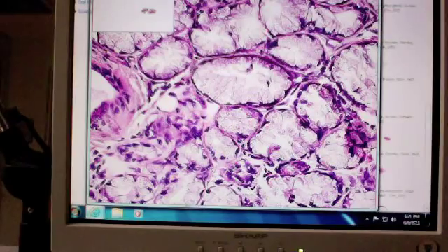And if I put a circle around this structure here and said name the structure, where's my next person? What is this structure? Acinus, correct? Or if I have multiple acini. Right, secretory acinus. If you wanted to write it all the way out because you don't remember acinus, the secretory portion of the gland.